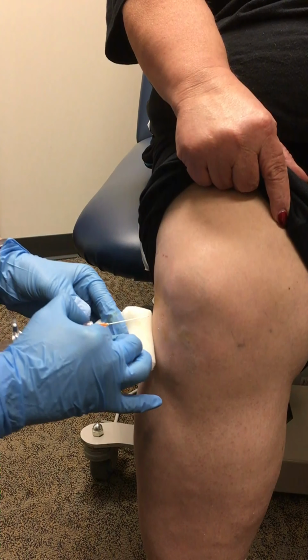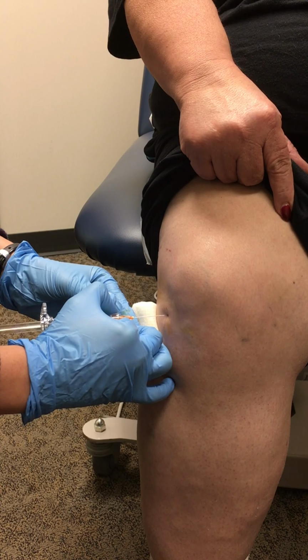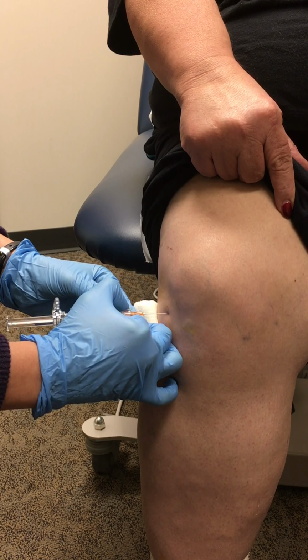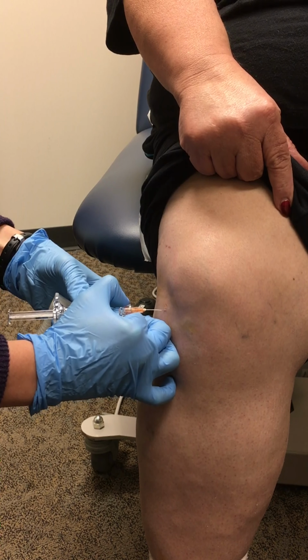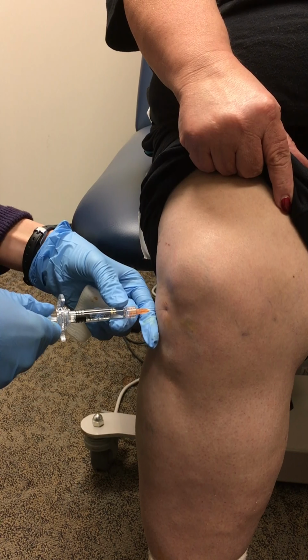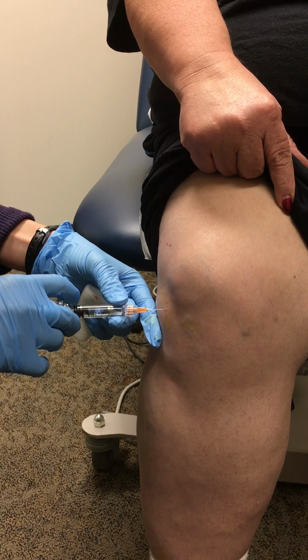And then we go at about a 45-degree angle. 1, 2, 3, little poke. Try to poke fairly quickly, but then move the needle in a little bit more slowly. Aspirate just a little bit.